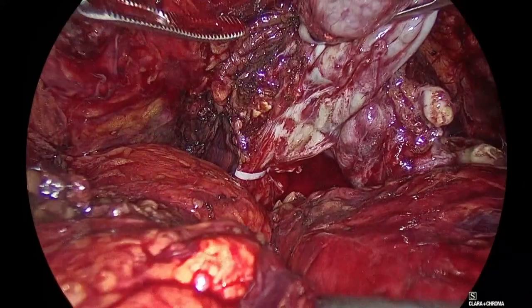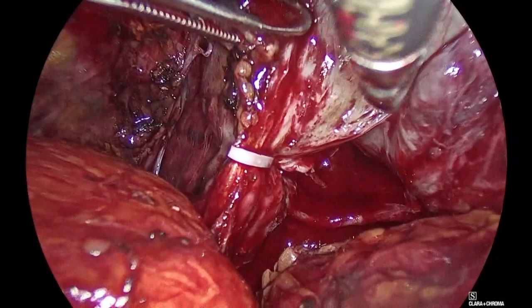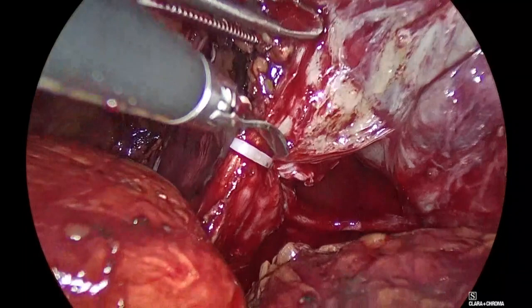So it's important that you see the prostate on the left side. You have your prostate on the lower part. Aspirate here, Panagiotis, please. Good, so you see your borders. You see the capsule here. I really need to be very careful and stay outside of trouble, eh?